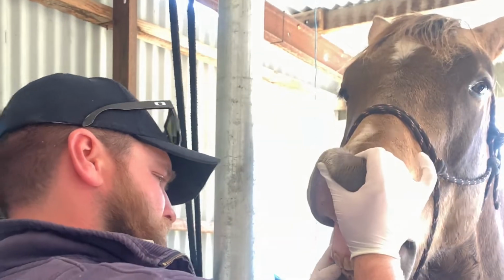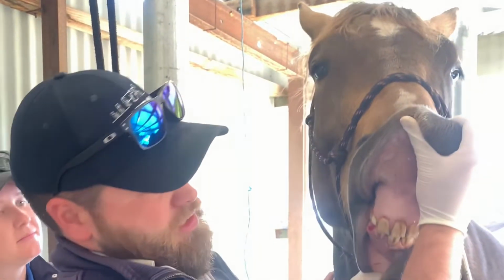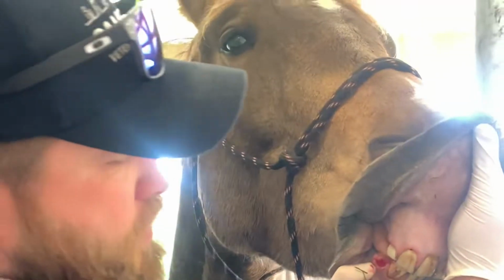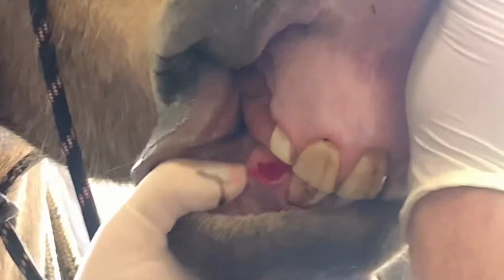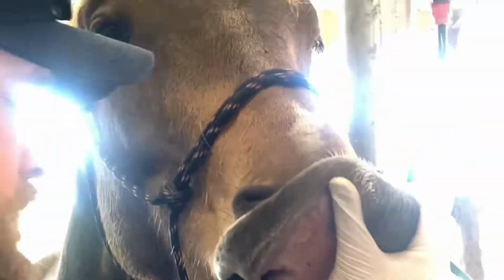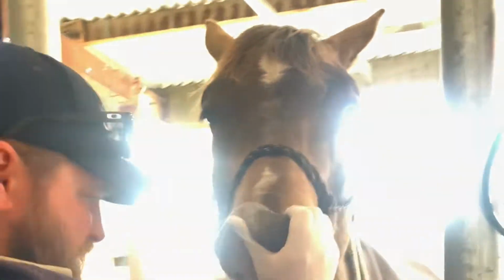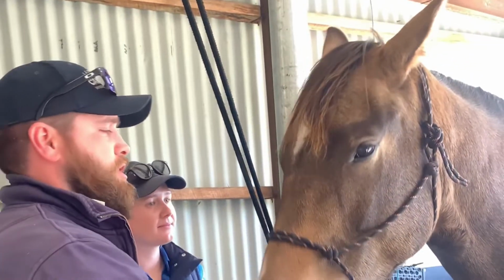He's got a few little grass seeds packing in there. They're not too bad. I noticed this in the paddock: he had a remnant of a tooth on this side, which has come off and left a little ulcer, which is what's packing with some grass seeds. And there's the adult tooth erupting underneath it. It's all relatively normal. We just keep an eye on it as it's tracking to see if there are going to be any problems associated with it.